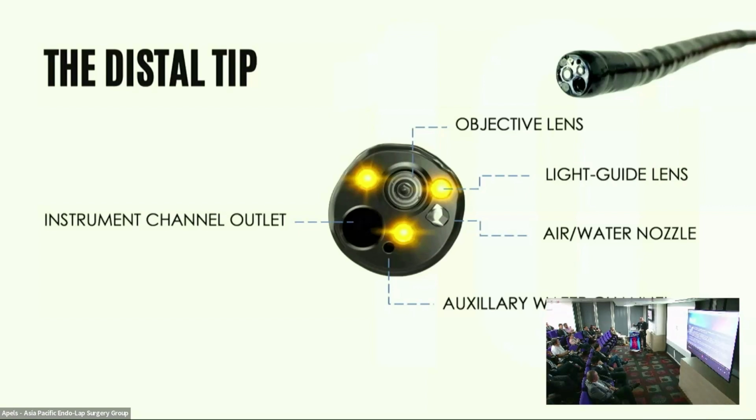Sorry. It will go through, but very tight, because it's 2.8, it's 2.3 for 7 French. But a 10 French tube will not go through a 2.8 channel. So you'll need at least a minimum of 3.85 channel, and then 4.2 will be the easiest. You might even be able to put two 6 French tubes in a 4.2 channel.